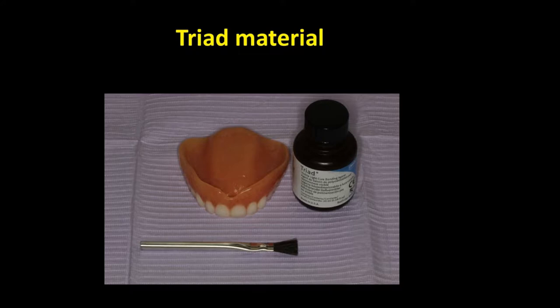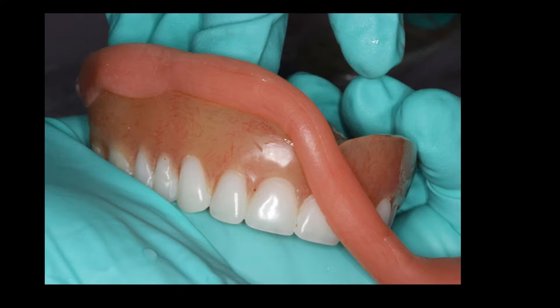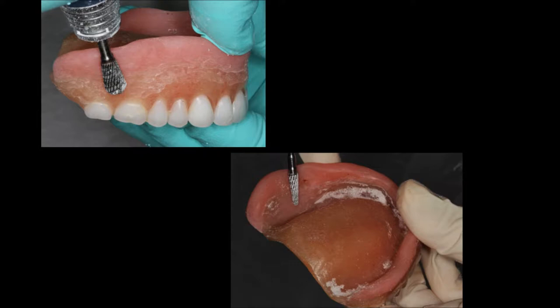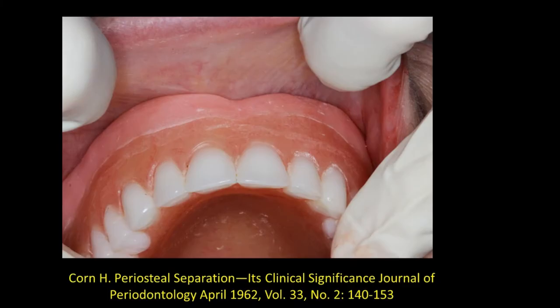The first step is to lengthen the flange on this denture using triad material. Before placing the triad material, the denture is roughened and a bonding material is applied to enhance attachment of the triad material. Here we are now adding the triad material, which in soft form will be placed in the mouth and some border molding done before final curing. Following the final curing, the denture is finished and polished as you would any other denture. This is the stent denture or treatment denture with the bonding material lengthening the flange — in this case about 5 millimeters.